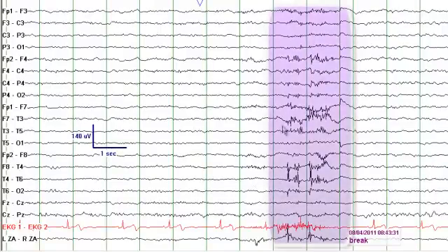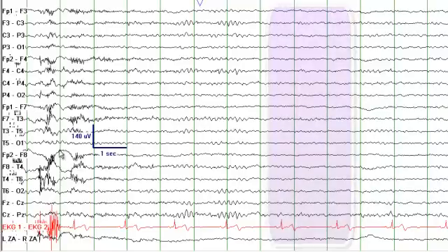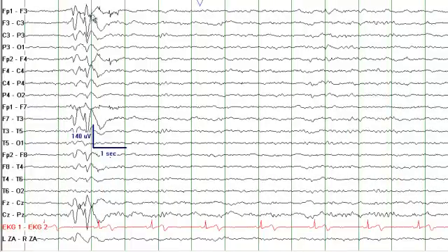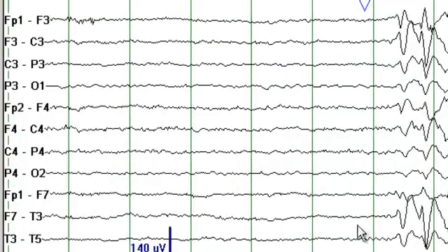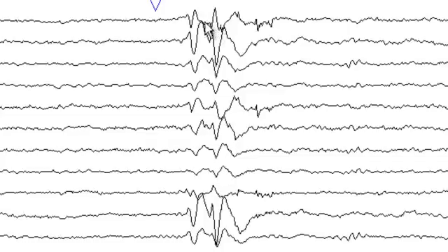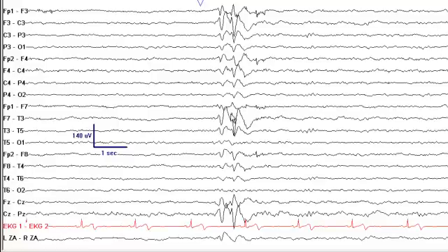There is muscle artifact in a generalized distribution. There are sharp waves noted at F3 and F7. Removing the grid lines, you can see a phase reversal at F3 and a sharp wave at F7 as well. This is where you have the epileptiform activity.